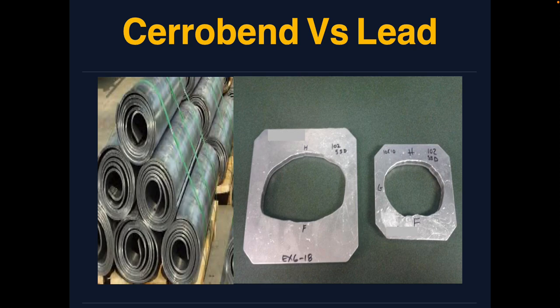In clinical practice, I would recommend that you ask your mold room team to make a full range of Cerrobends. You don't have to make specific ones for each patient. You make circular Cerrobends, you make squares, different measures of squares, and then you try to adapt or use the pre-made Cerrobend in your field, and this will be the easiest way of doing things.